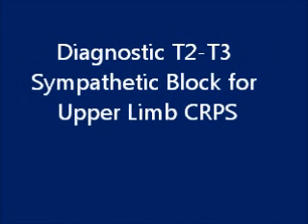The thoracic sympathetic block is a procedure performed to reduce pain and to treat chronic conditions in the upper limb as well as thoracic region. This is a video showing the diagnostic T2-T3 sympathetic block for upper limb complex region pain syndrome.